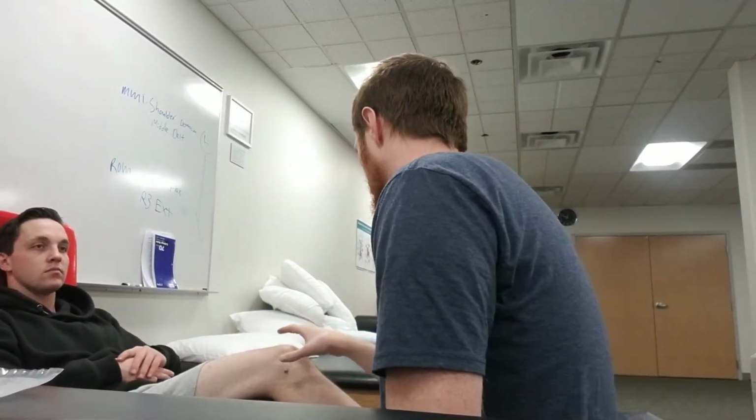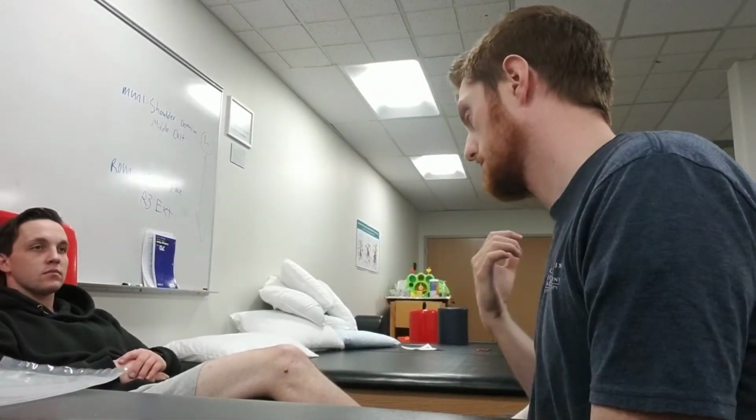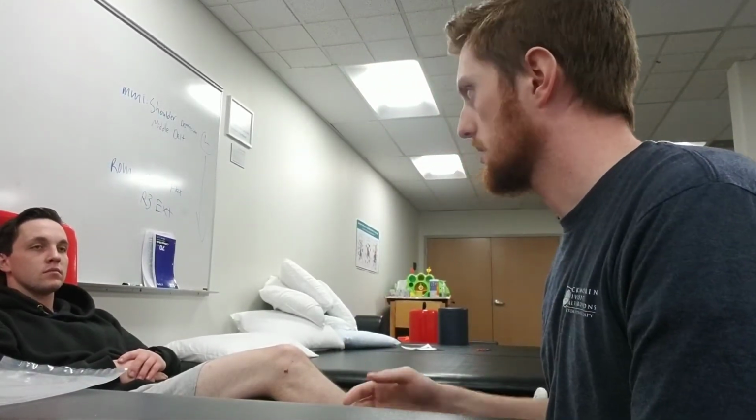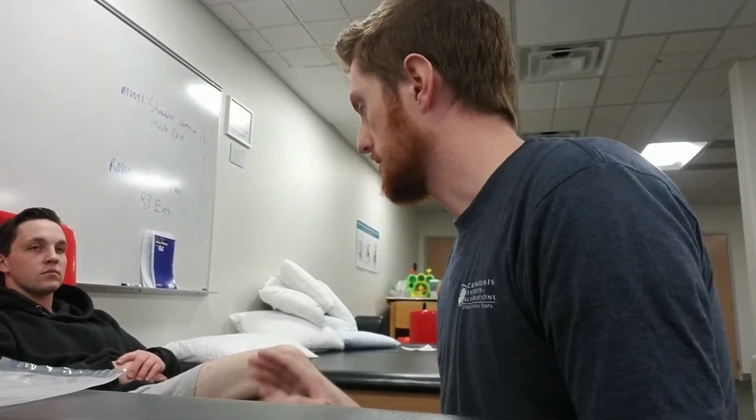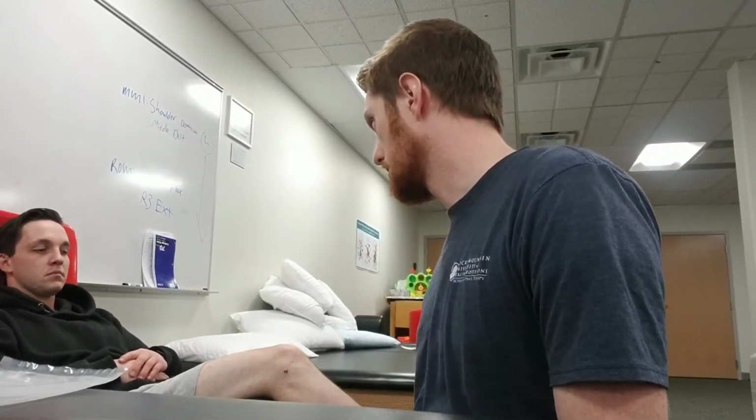Okay. All right. So is it all right if I place my hands on your leg and knee area? Yeah. And place your pads on there? Okay. We're going to give you your own set of pads because we expect that we'll be doing this a few times as you come to therapy. So you have your own set of pads that you use every time. Make sure that we keep them clean. Okay. And we got you up on a bolster here. Are you comfortable there? Do you need a pillow under your other leg or anything? You're comfortable? Yeah, I feel comfortable. Okay, awesome. And when we put you on this, we'll do it for about 20 minutes. Just for this first time.